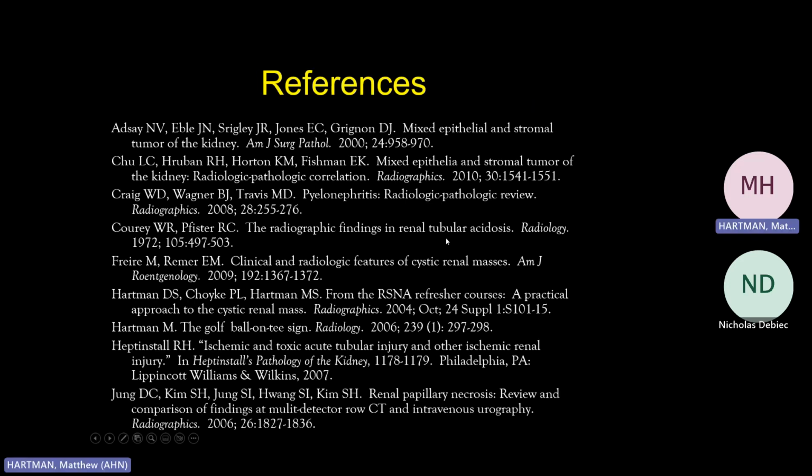So that was a quick tour through the GU system of pathology. We hit some of the highlights. Again, I encourage you to take a closer look at the whole presentation, go back and forth, and think about those tumor tipping points. If you have a lesion, think, is it solid or cystic? And again, look for those patterns of pathology: innie, outie, narrowing, dilation, thickening, and displacement.